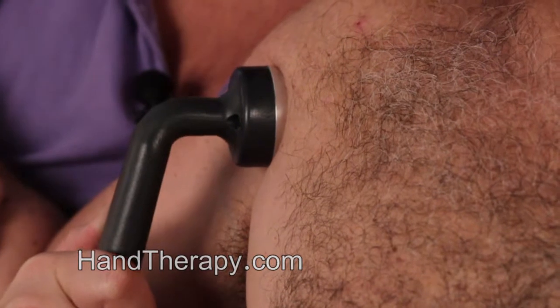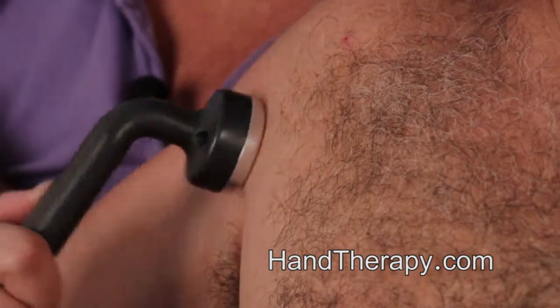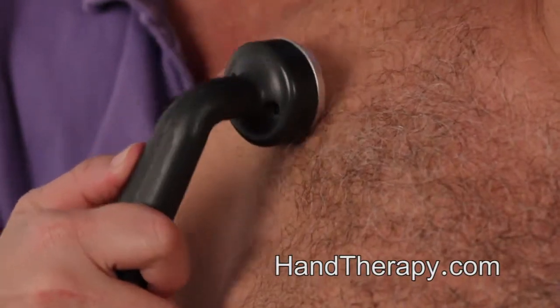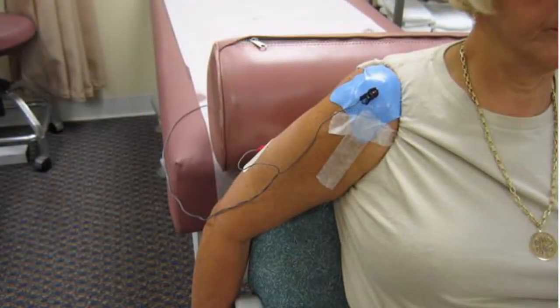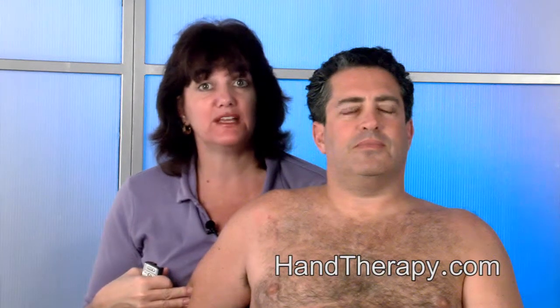What if they have impingement syndrome? Where will I want to position my patient for the best targeted exposure of the targeted tissue? I'm going to bring the arm now into internal rotation and extension and apply the ultrasound right here. Also, if you're using iontophoresis, as you can see from the clip art, you can also put your pad in the same area, and the patient's arm must be in the best position for the exposed tendon.